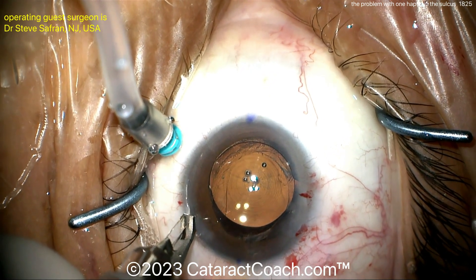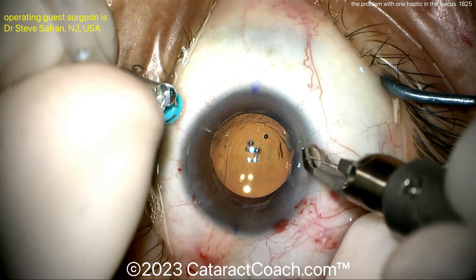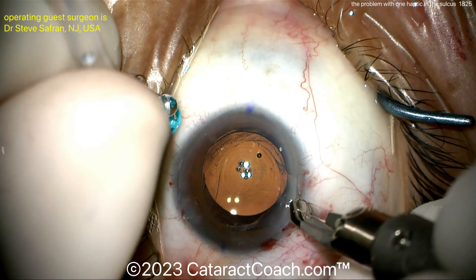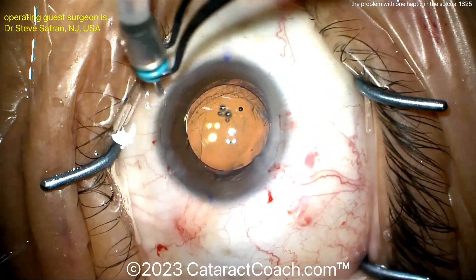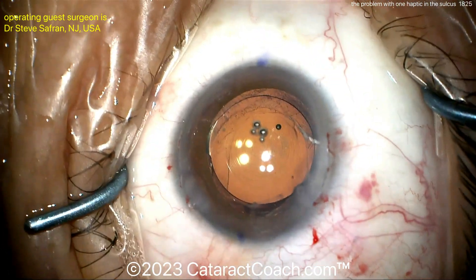So keep in mind: don't ever let one haptic be in the sulcus while the other's in the bag. That's a recipe for a big disaster. It can be repaired like an expert does in this case, but it's better to just prevent it in the first situation. Taking out that last trocar — look at that. Stable, stable lens. Beautiful result.